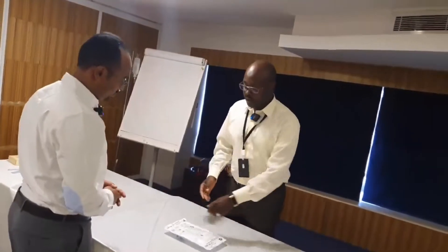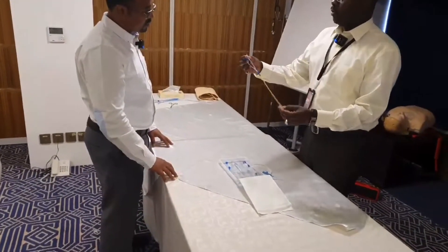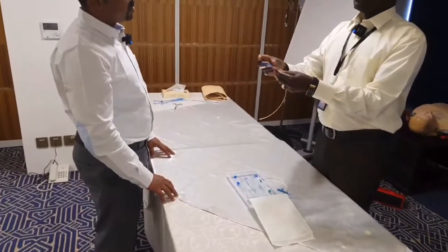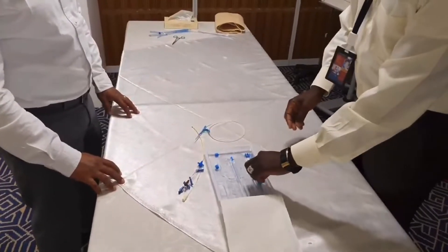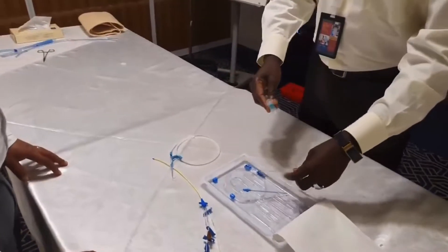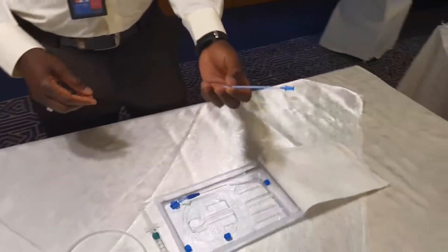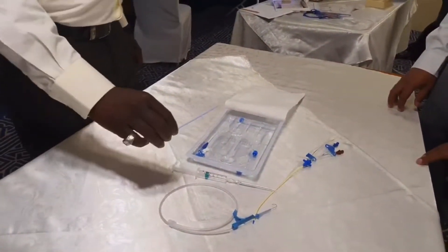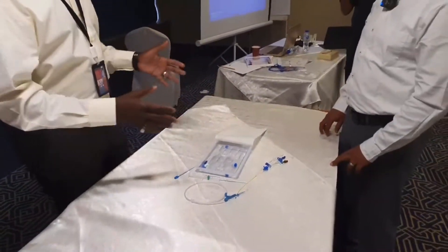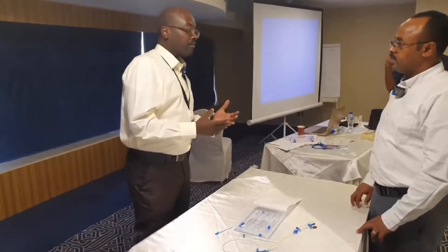We have the equipment. This is the central line — here you have a three-lumen central line. Sometimes it comes with two lumens, sometimes with more than three lumens, and in different sizes. This is the guide wire, and this is the introducer needle. This is the dilator. All equipment should be in a sterile fashion. We explain the procedure to the patient. We then prepare the local anesthesia — check its validity and calculate the dose.